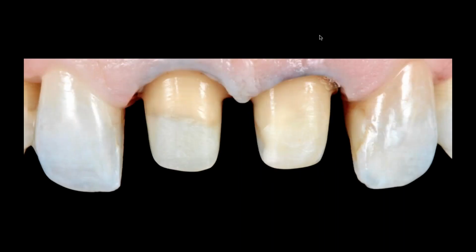Okay, so this is a case of, let's say, moderate complexity, endo-treated teeth, so I can prep them very symmetric. Many of the mistakes I see in the preparation of these central incisors is that on the mesial and distal surface, we don't go subgingival 0.5 millimeters, so we don't create a nice vertical running room for the technician or for the clinician who is designing the restoration to provide a nice support.